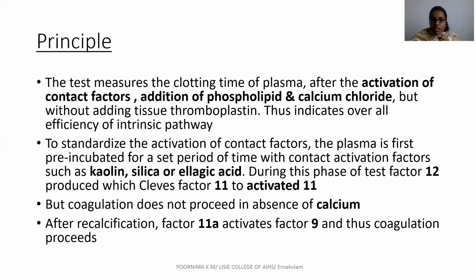Here, as we are doing the test in vitro, we are adding the contact activation factors such as kaolin, silica or ellagic acid. So these contact activation factors along with the phospholipid cause activation of factor 12.